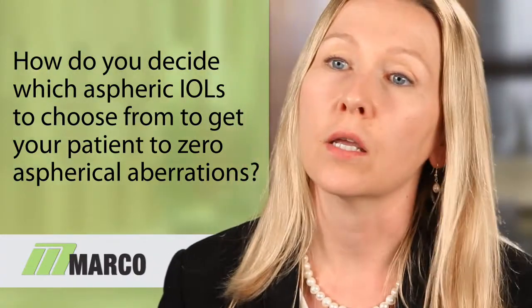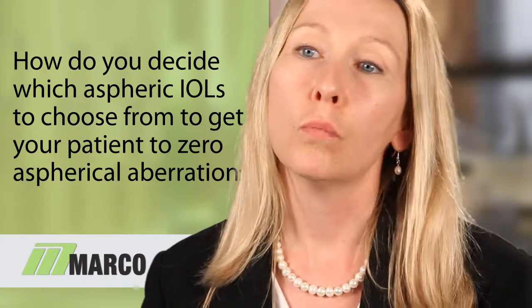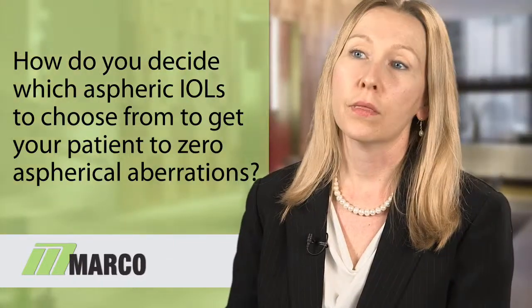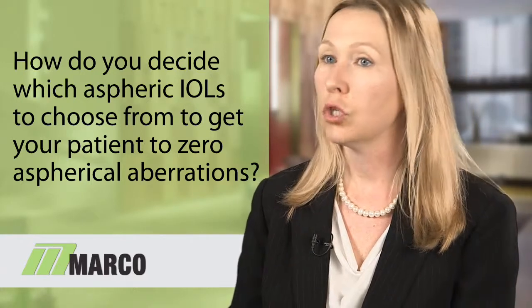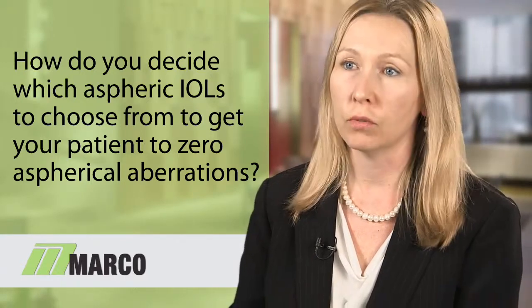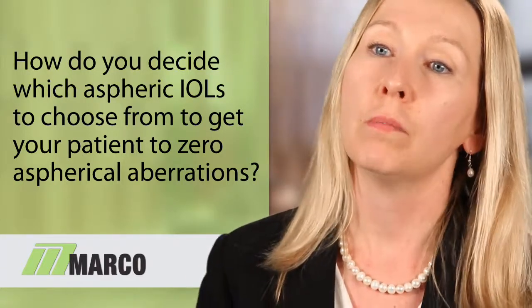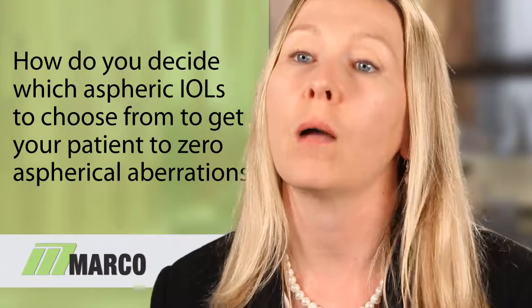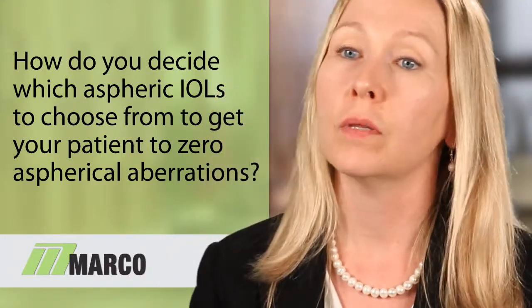An interesting case that I can share with you is that we had a patient recently who presented with a nicely implanted IOL with a best corrected 20/20 vision, who was very unhappy. And she was not a premium IOL patient, but she was still very unhappy. We went to the OPD and realized that she had been implanted with a negative spherical aberration lens of the highest power, and her negative spherical aberrations were extremely high.